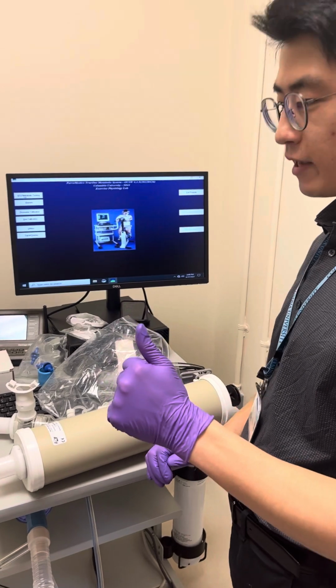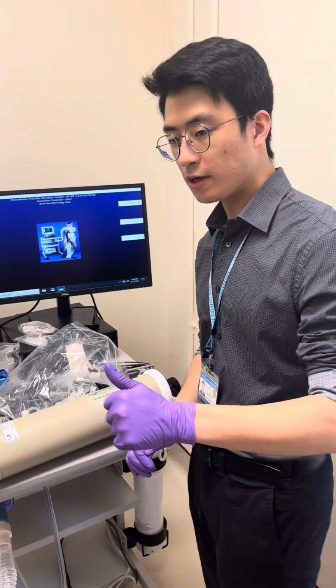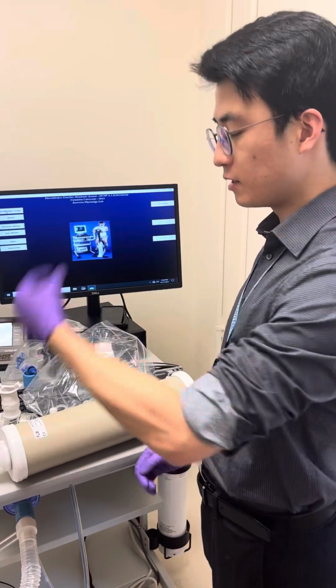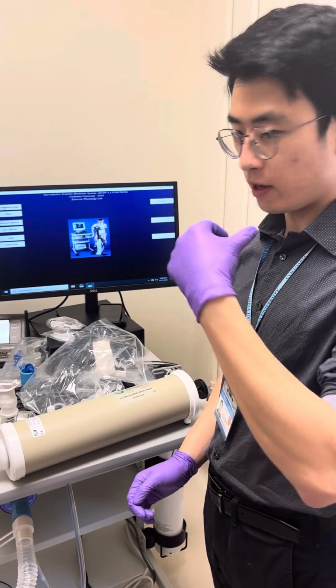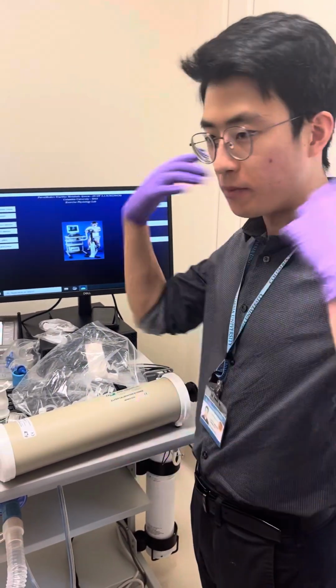Last thing you should probably have on hand before the test begins is some water. People will come in and their mouth may be really dry. One thing to note is that when you put the nose clip on, you can't swallow spit, or you can't do it well. It'll pop your ears.